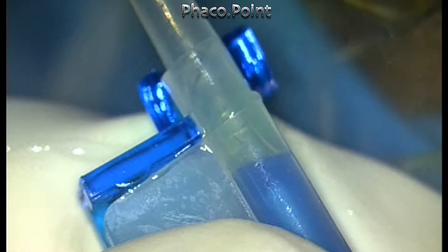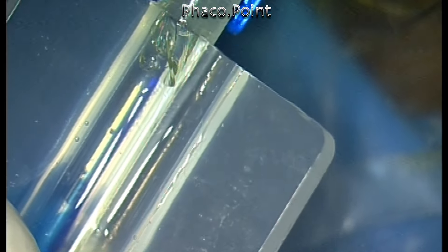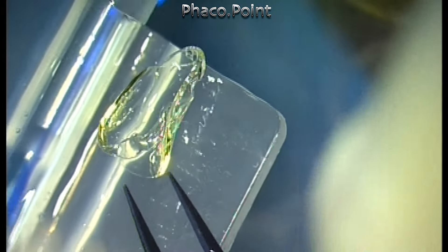At this point I abandoned the attempt. I opened up the flaps and pulled out the lens, which was bunched up near the nozzle. To my great relief, I found that the IOL was not broken or damaged in any way.